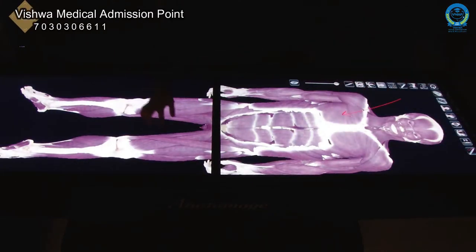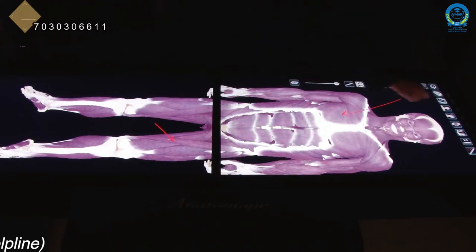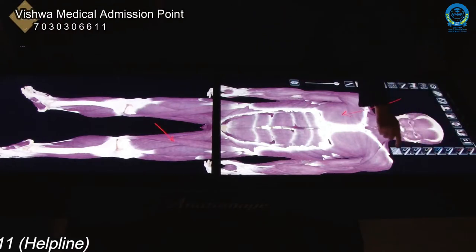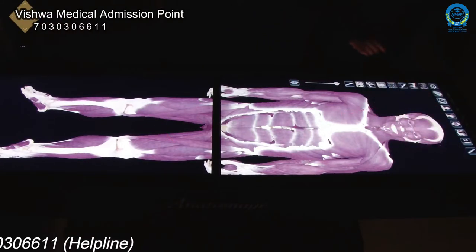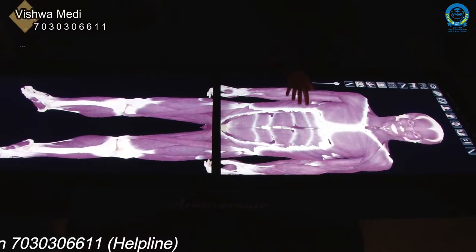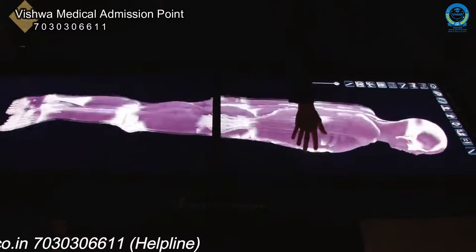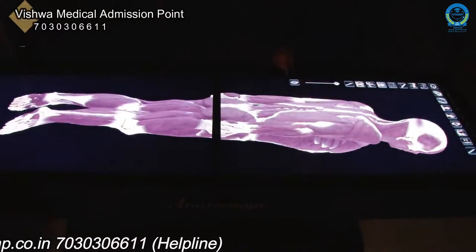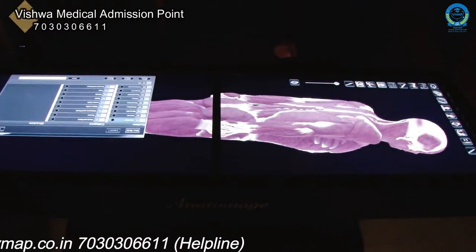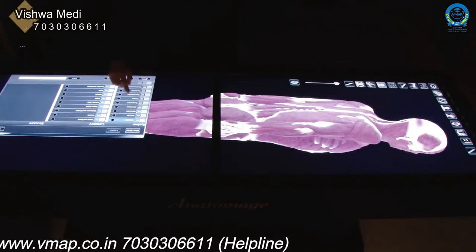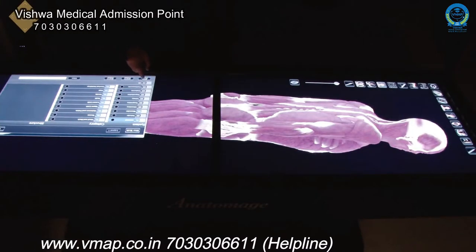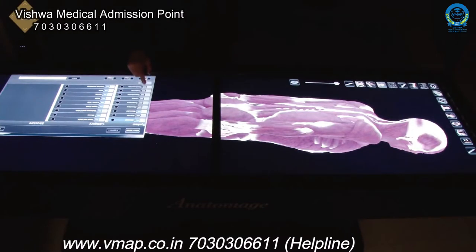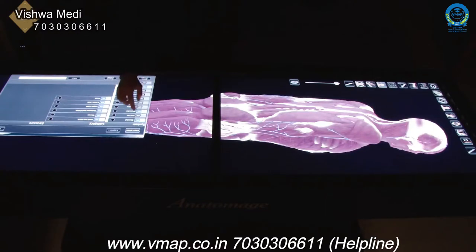Students can draw on the table, annotate it themselves, make self-quizzes, and do self-study. This table is available during open lab, so students can come in at their own free will and, under the lab supervisor, work with this table.